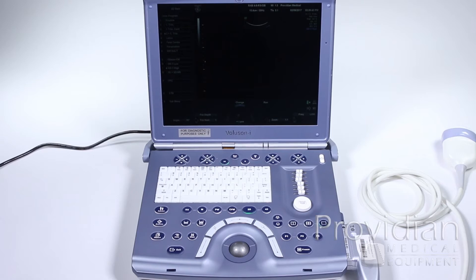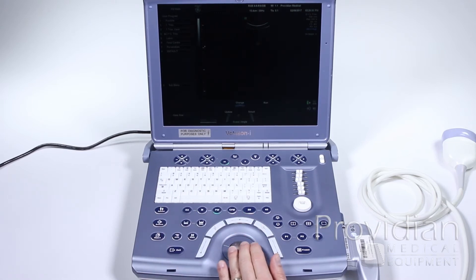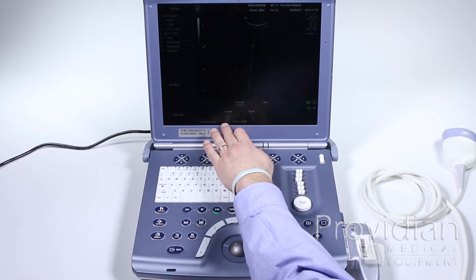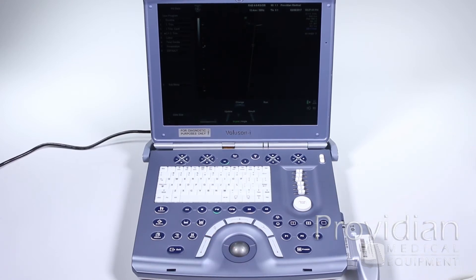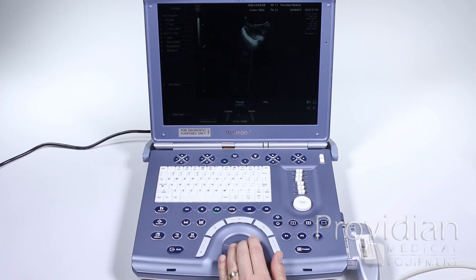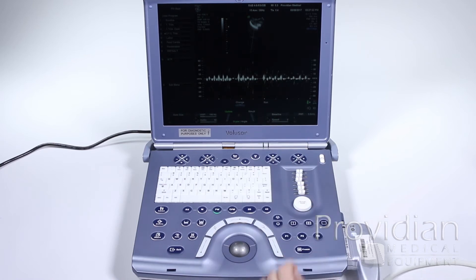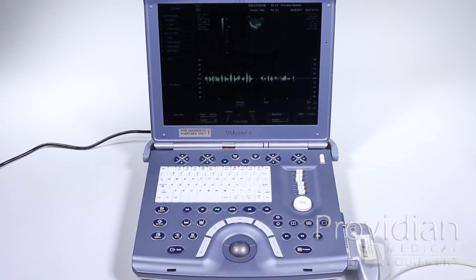Now let's take a look at Doppler. To get Doppler, press the PW button — it will give us our Doppler gate and our Doppler line. We'll position this over the area of the vessel or heart where we want to listen. We have update, which gives us a frozen 2D image and a live spectral Doppler, or simultaneous, which gives a live 2D image and spectral Doppler.